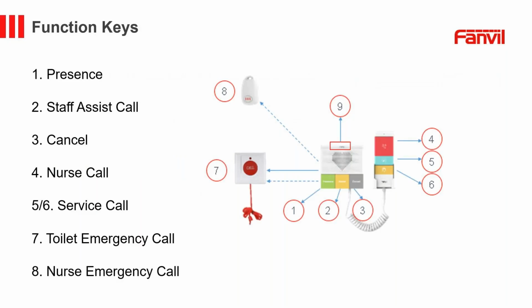Function keys on the nurse call cell phone, such as presence, nurse call, toilet emergency call, and nurse emergency call. So these provide access to frequently used features. These can be customized to suit the needs of the healthcare facility. So there are many function keys.